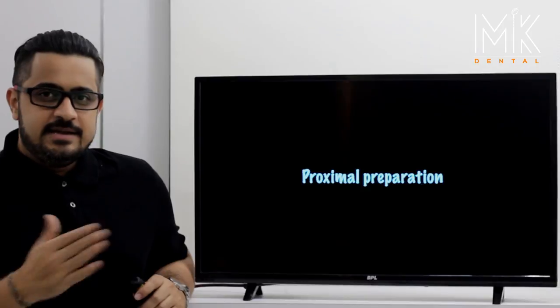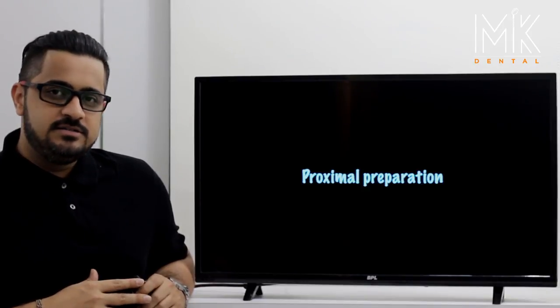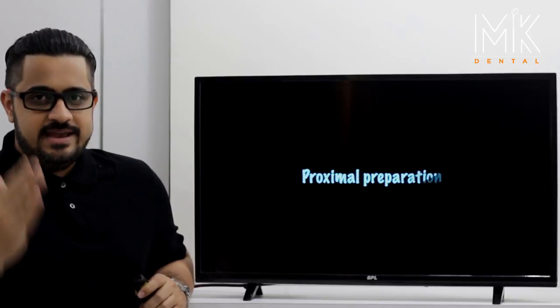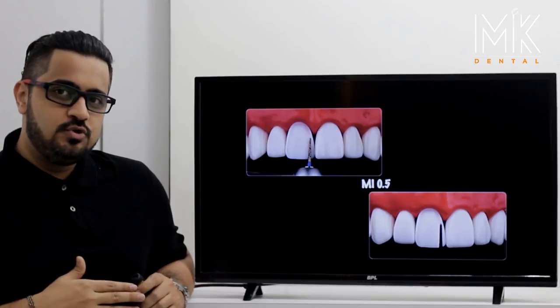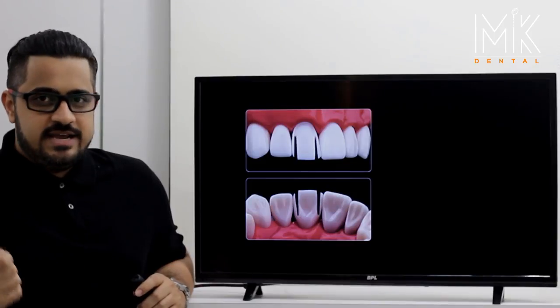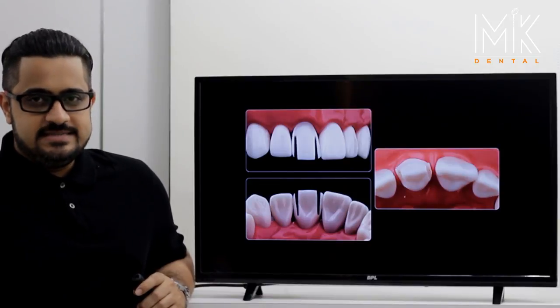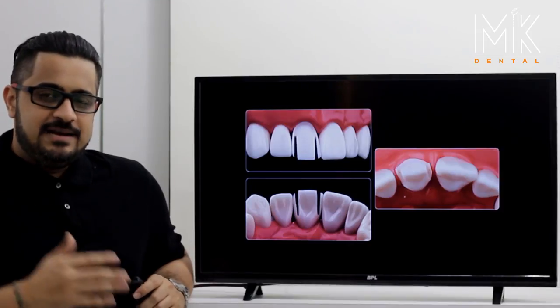We now move to the interproximal aspect. The exact same protocol of the modified interdental burr is used here. The MI 0.5 burr — the thinner of the two — is used, kept slightly supragingival. Being a non-cutting tip, you simply slice through the proximal area, opening up the mesial and the distal. You take your probe and fracture the segments. What you've achieved is opening of the contact without traumatizing the adjacent tooth or the interdental papilla.